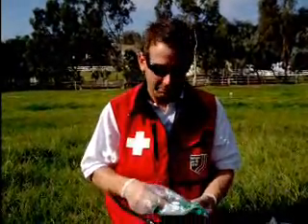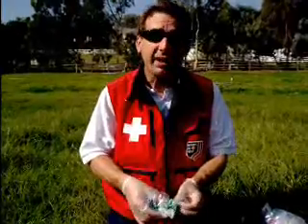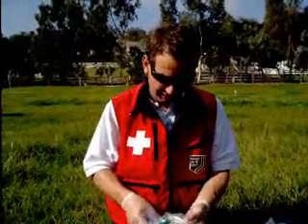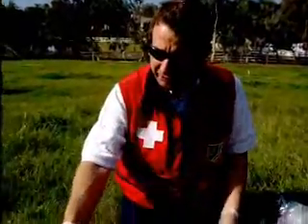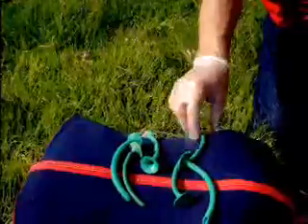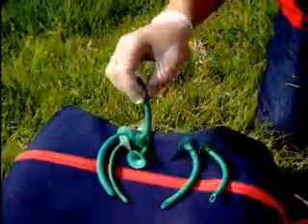Hi, I'm Robert, and this skills video is a quick demonstration of using nasal airways. We use nasal airways when we can't use an oral airway and we need to keep the airway open. There's a few things to remember about the nasal airways. First, they're in multiple sizes, just like oral airways.